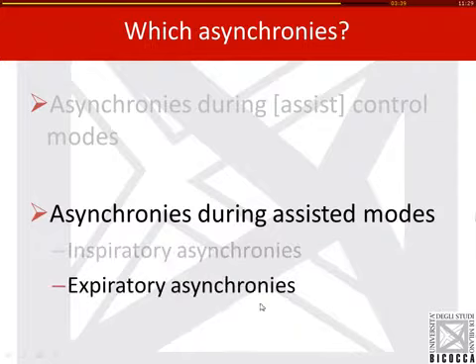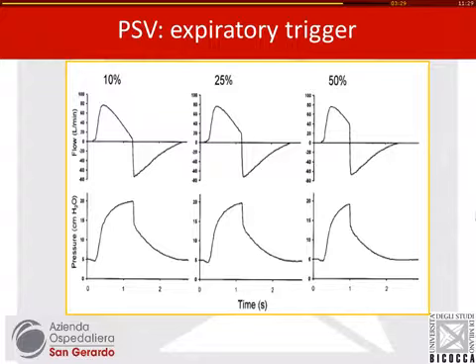And finally, the asynchronies during expiration, which are potentially as relevant as those during inspiration. This is a little bit more specific to pressure support, but still, I think pressure support is very widely used, so I hope you will find this useful in your clinical practice.